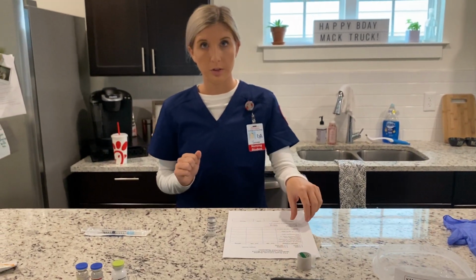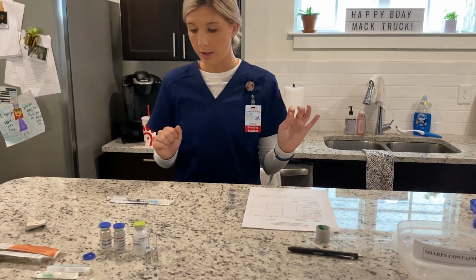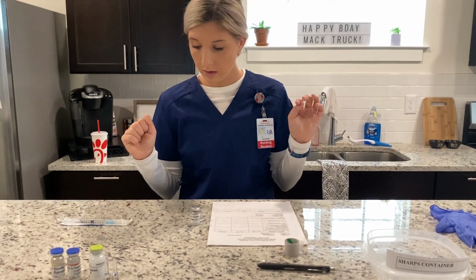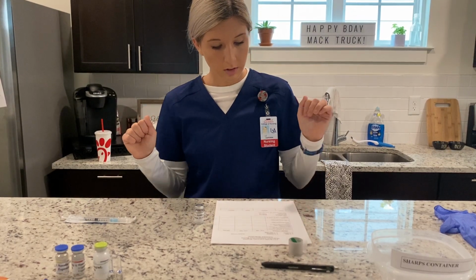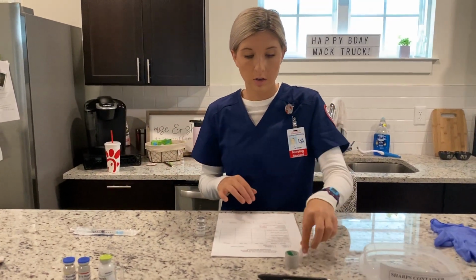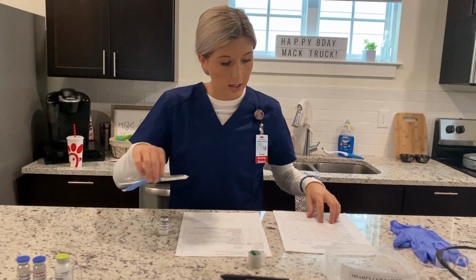And then I'm going to do the second check of accuracy, and I'm going to make sure that it is the heparin of 5,000 units or 0.5 milliliters subcutaneously for the TB syringe, and then every 12 hours, and it has not been given in the last 12 hours. So I'm going to grab my MAR and my syringe and set it aside to bring to the patient's room.